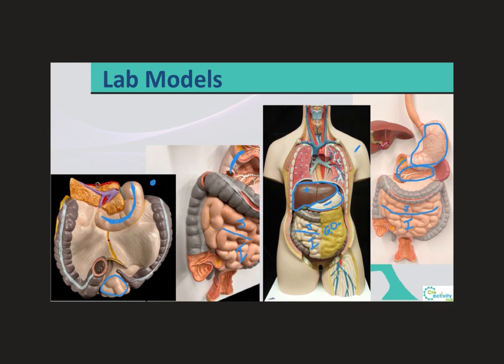And this is one of the mesenteries that actually hangs from the stomach, and it's made up of fat tissue that will actually support and cover all the organs and the intestines that are found in the lower abdominal area. Now, it also serves as fat deposition, which will vary in the amount depending on the individual, as you can imagine.